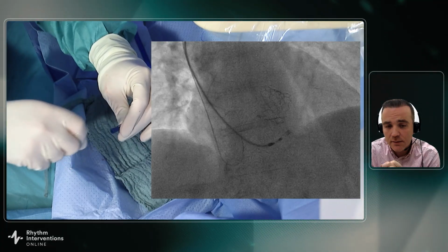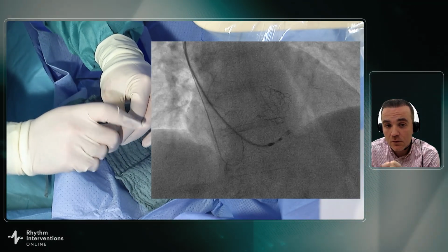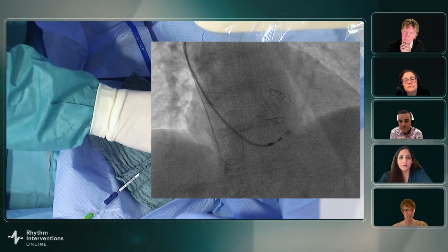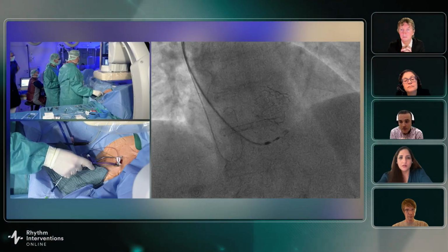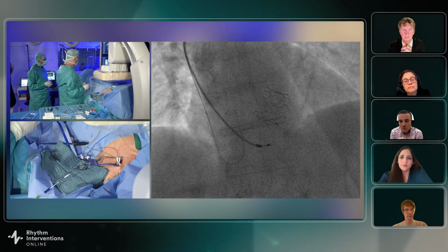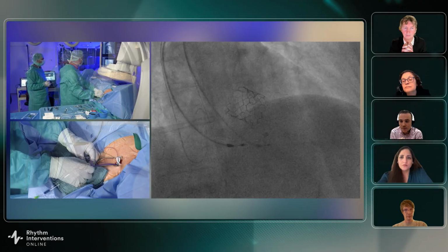Again with stylet. Here you have the TAVR valve to guide you, but in your practice, do you use contrast or map the His when you're using Boston Scientific or stylet-driven leads? In general, or maybe sometimes when we are not sure we could use contrast. We don't map the His.